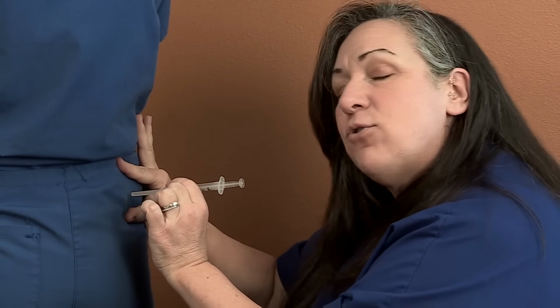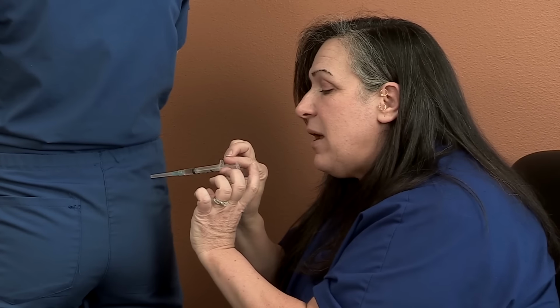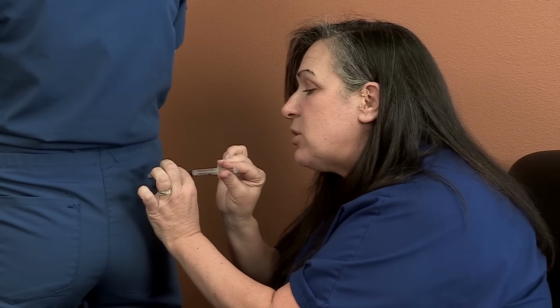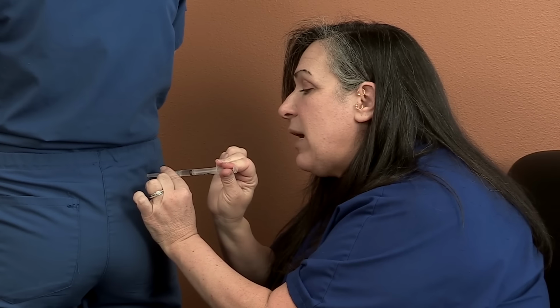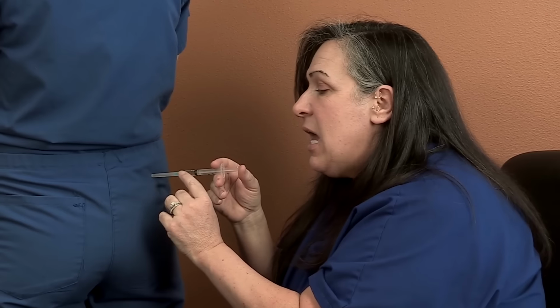Now, one of the tricks we have to do here, because this is a deeper injection, you've got to aspirate and just make sure you're not hitting a little blood vessel, a little capillary or something. So once the needle's in, you can let go. And what you're going to do is pull up ever so slightly on this plunger. When I do that, 99 out of 100 times, I'm going to see what I just saw there, a little air bubble. And I know I'm going to be perfectly fine to do that injection.